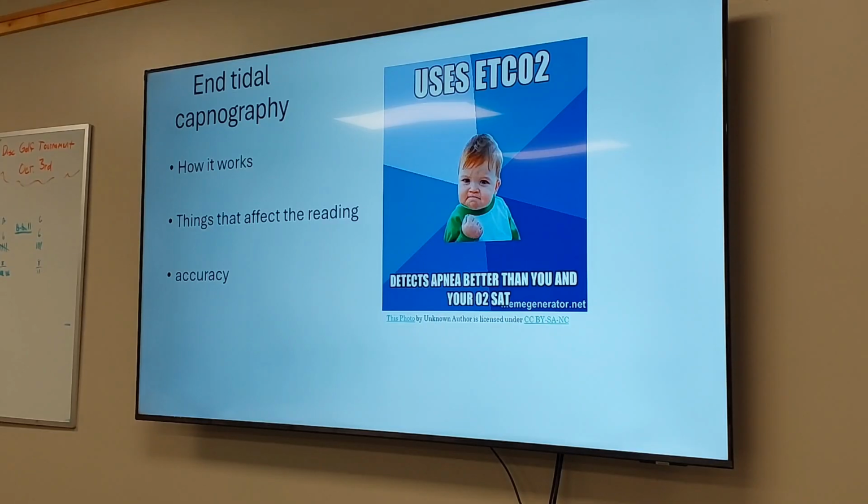Can you use a capnography if the patient has a nasal cannula on? Well, the end tidal has a nasal cannula. So don't they interfere with each other? No, they're together. Your end tidal has the nasal cannula with that little tail. You don't put another nasal cannula on. If you have a patient on 2 liters of oxygen, you pull it off and switch it completely from their nasal cannula to the end tidal one with the nasal. I wouldn't try and put 2 in there.